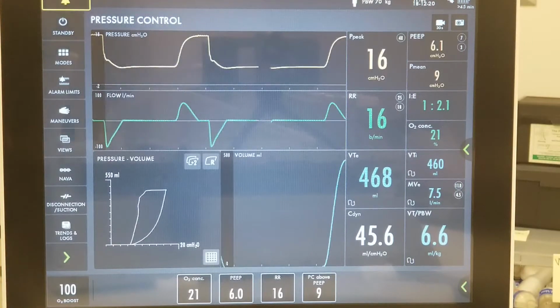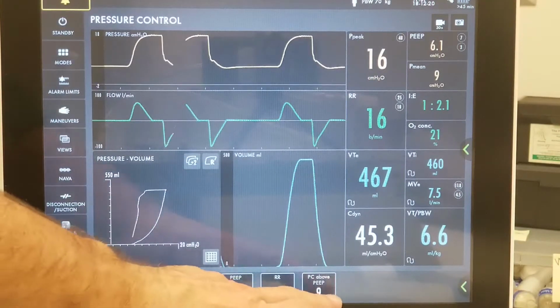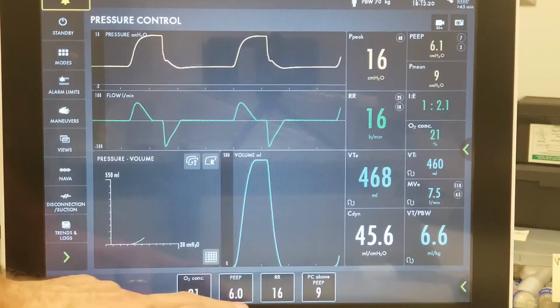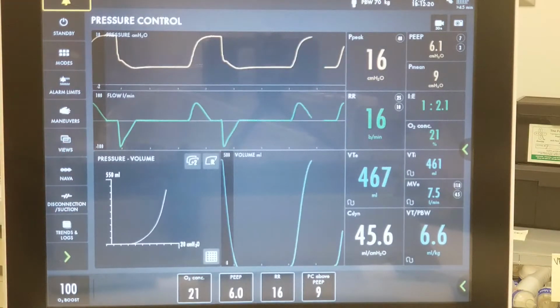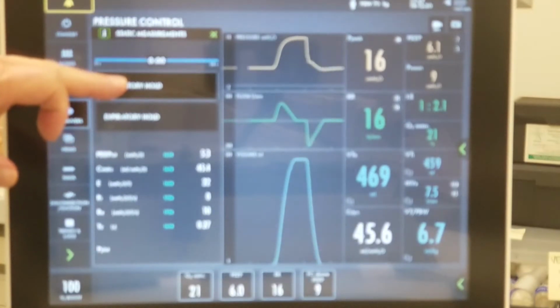What is the impact of changing patients' compliance or airways resistance? So setting our pressure 9 above PEEP, which is 15, right? We're getting 1 of overshoot. So we're actually going to 16, even though we've got it set to 15, right? Now, what's our plateau? Well, let's try an inspiratory maneuver and see what we get for a plateau pressure.